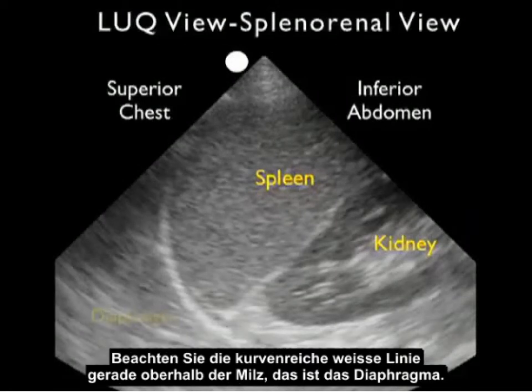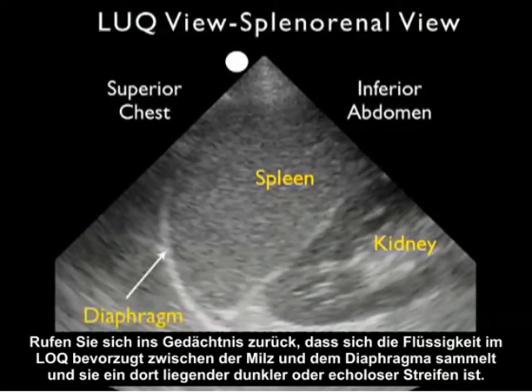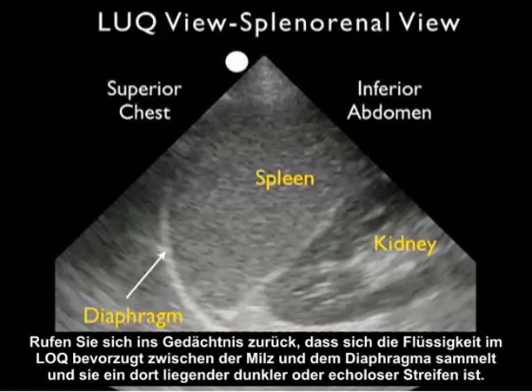Notice the curving white line just above the spleen, which is the diaphragm. Recall that in the left upper quadrant, fluid will accumulate preferentially in between the spleen and the diaphragm and will appear as a dark or anechoic stripe positioned there.